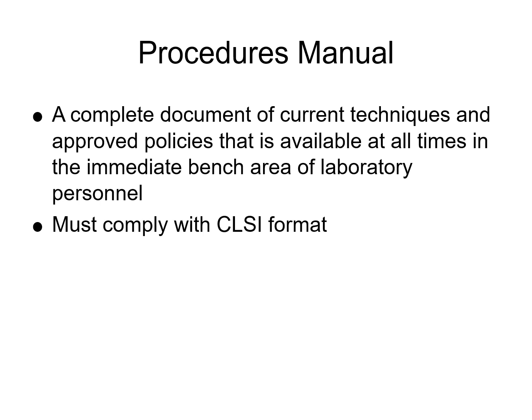The approved policies and procedures, so there are standard operating procedures and quality control guidelines and safety protocols and biohazard handling. For compliance standards, it has to comply with CLSI format. So CLSI is the Clinical and Laboratory Standards Institute. The document must follow the CLSI formatting and guidelines, including clear headings and numbering, stepwise procedural instructions, documentation of reagents, equipment, and QC measures, references to applicable regulations and quality standards.